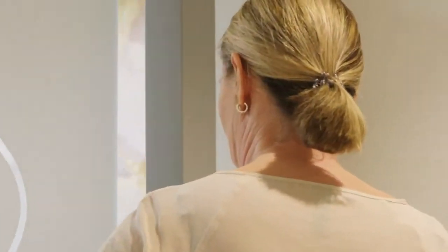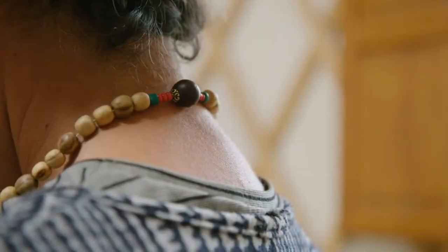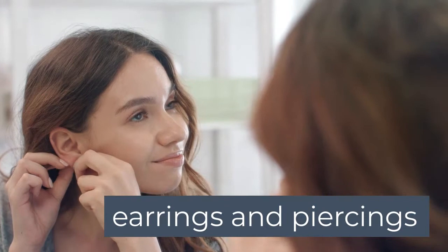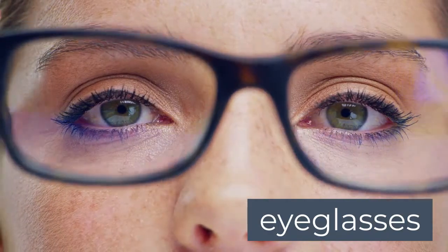You don't need to know anything or prepare anything beforehand. You'll need to remove any metal from the neck up, such as jewelry, necklaces or earrings, piercings, and also remove your glasses.